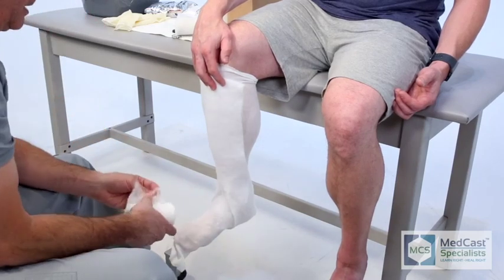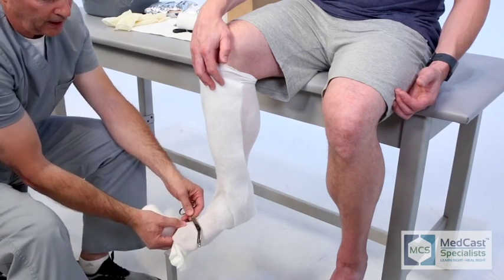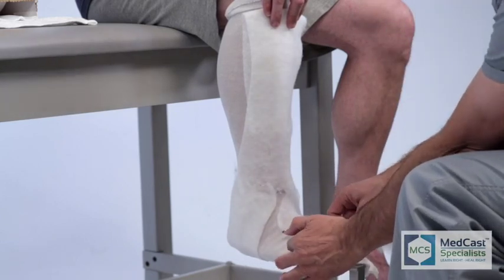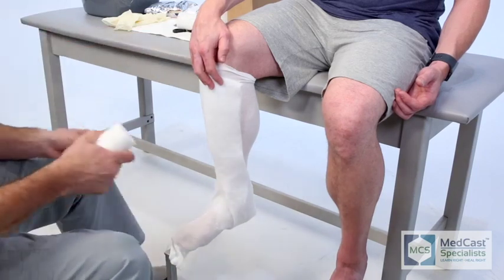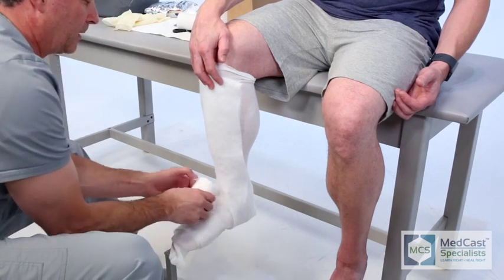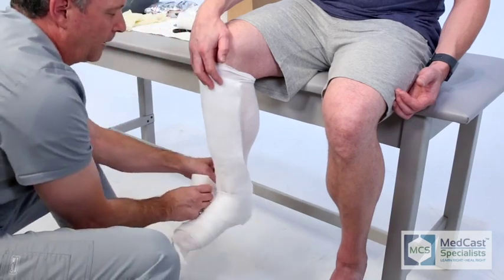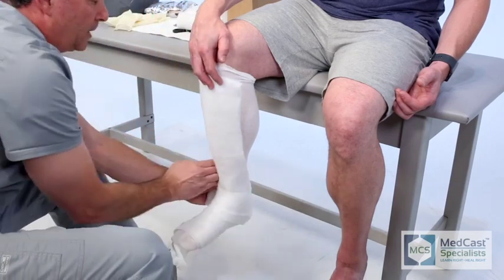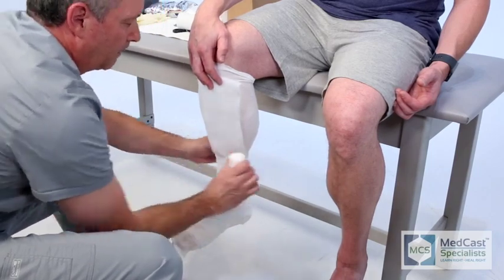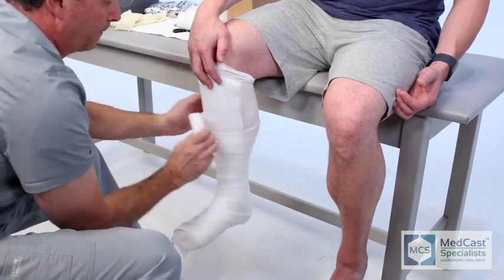Short leg casts will usually expose the toes, though there are also techniques that will encase the toes and bring it out to the distal end. When you lay your cast material down, you don't really want to go straight across — you want to go on an angle. Cast padding you want to put straight across so that you have adequate padding on the distal ends of the toes. Go through and make certain that you're not generating a lot of wrinkles. Your cast will look as good as your underlying cast padding; if you have a lot of wrinkles and unevenness, your cast will display that on your end result.